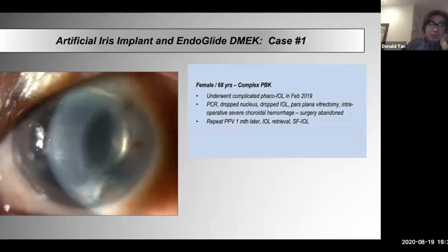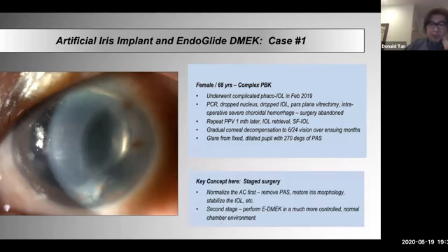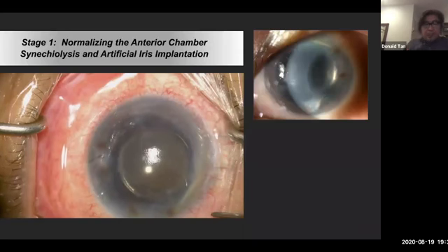Then about a month later, they went in again, did a vitrectomy, retrieved the IOL, and did a sclerofixated implant, which was okay. The implant's in place, but you can see the anterior chamber is pretty damaged. The pupil was fixed and dilated, with peripheral anterior synechia, and then the cornea decompensated. So the patient gets about 6/24 vision, a fixed dilated pupil, and about 3 quadrants of peripheral anterior synechia. So the concept here is to normalize the AC first, restore the iris morphology, and then secondly, perform DMEK. Here's that patient.